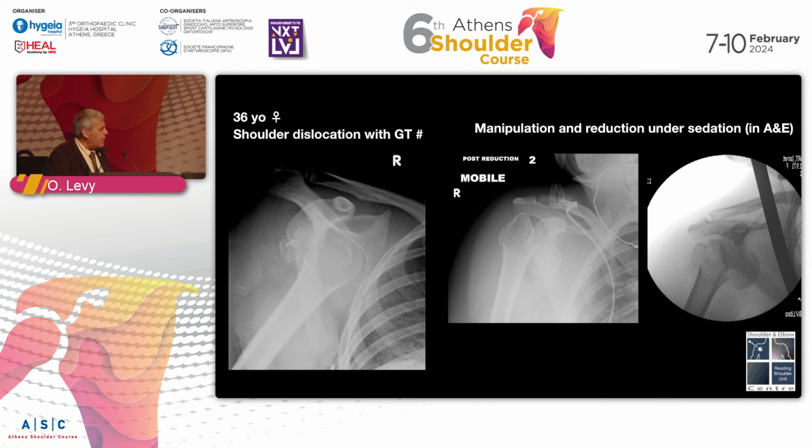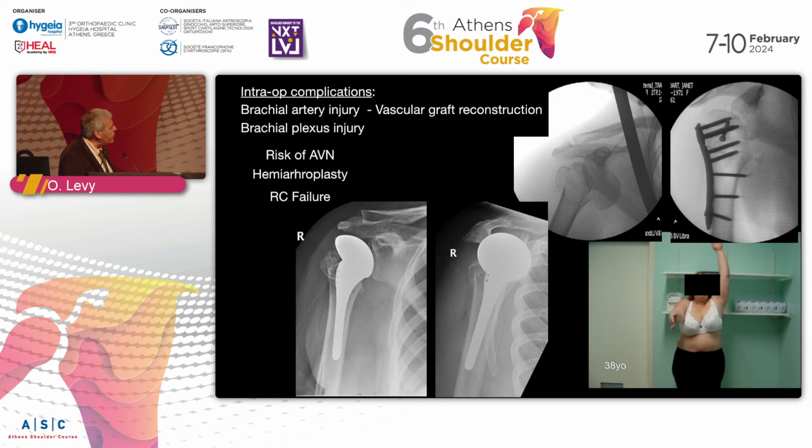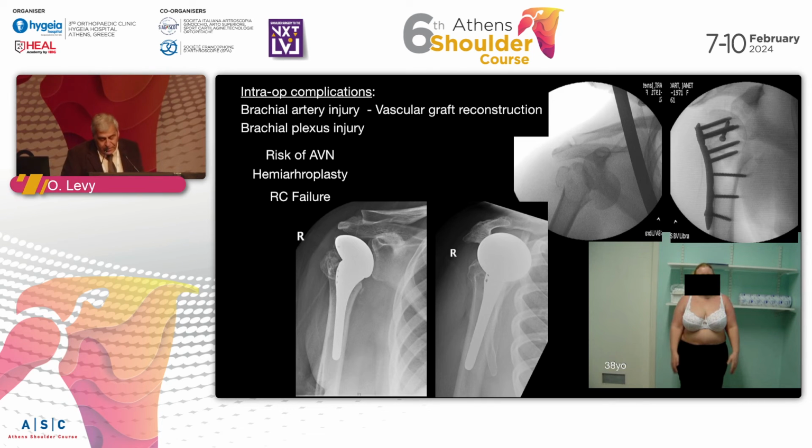Again, a few cases of fracture sequela. This poor lady, age 36, had this fracture dislocation. Someone decided to reduce it in A&E, and of course, what he did, he fractured it completely. She was taken to theater. In theater, the surgeon tried to reduce that. At that time, he reduced it. He actually injured the brachial artery, the brachial plexus. He called the vascular surgeon to do a graft, and then I believe he just put this plate the way he could just to get home as fast as possible. Obviously, this is not reduced. This developed AVN. He revised her to a stemmed hemi, and that's how she was referred to me, and she was desperate. And now I was concerned to do it, but she said if I'm not going to do it, she's going to jump from the highest building in Reading.